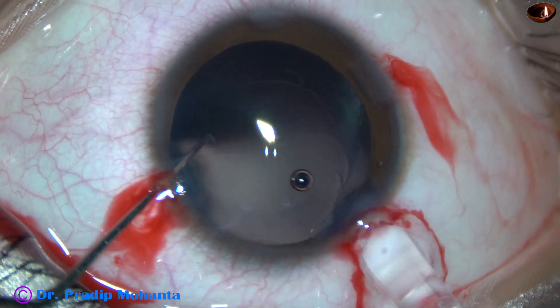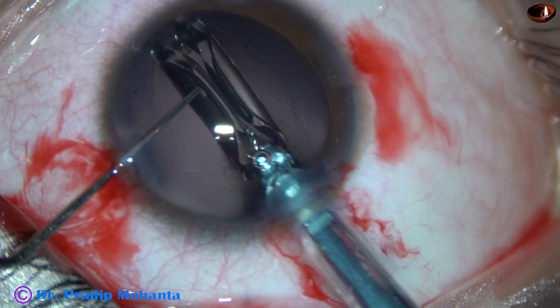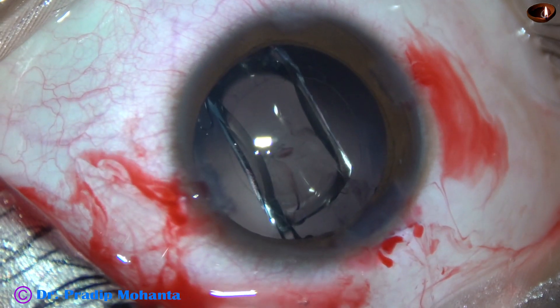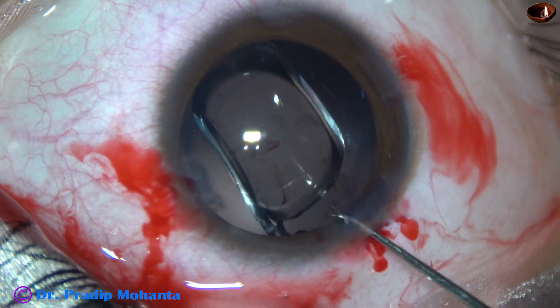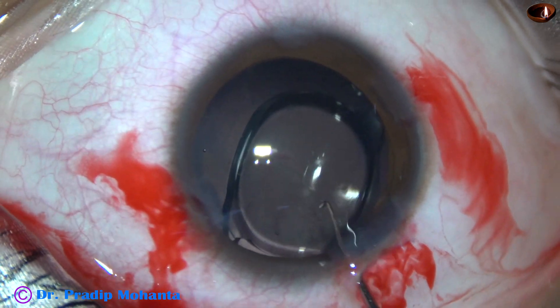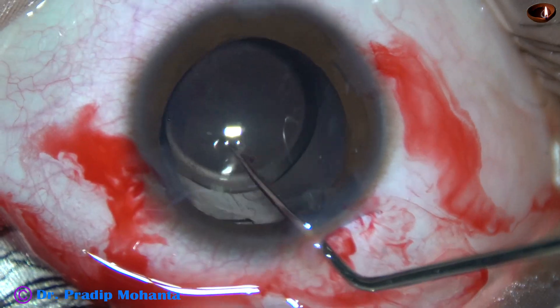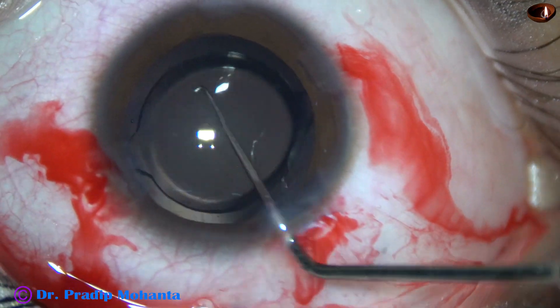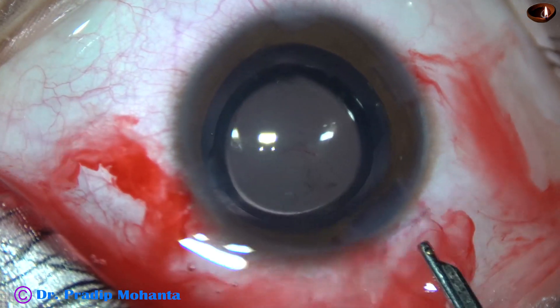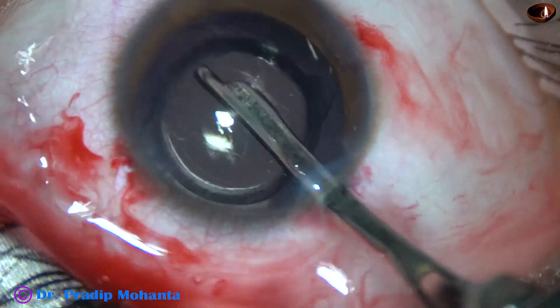And here goes the sensor wound. This is a beautiful lens from Johnson & Johnson — no financial interest, but this is a really good lens. The lens appears a bit bulky but once it is in the capsular bag it is very nice. The optic of the intraocular lens has been covered all around by the anterior capsular rim, ensuring beautiful centration of the optic.